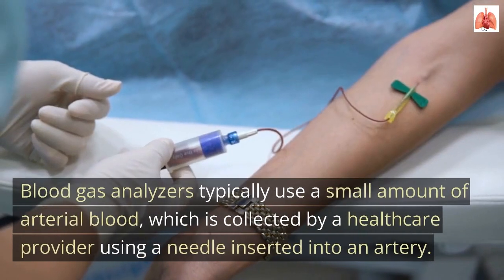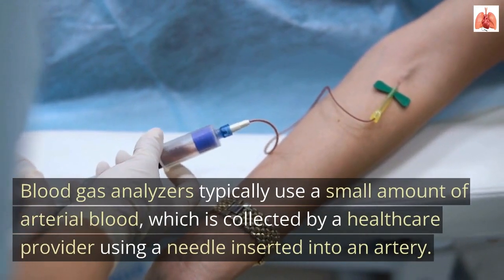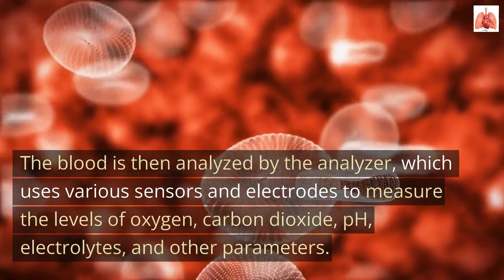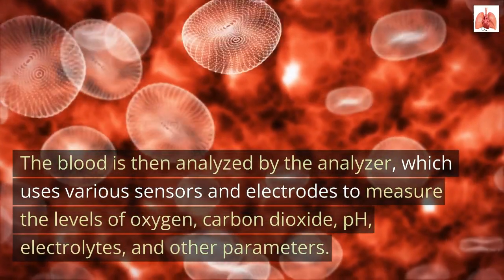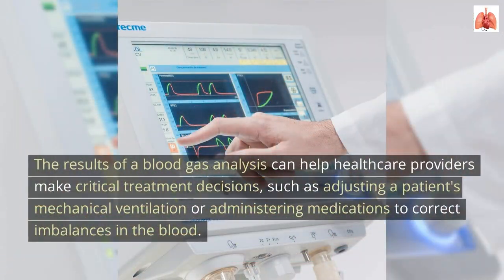Blood gas analyzers typically use a small amount of arterial blood, which is collected by a healthcare provider using a needle inserted into an artery. The blood is then analyzed by the analyzer, which uses various sensors and electrodes to measure the levels of oxygen, carbon dioxide, pH, electrolytes, and other parameters. The results of a blood gas analysis can help healthcare providers make critical treatment decisions, such as adjusting a patient's mechanical ventilation or administering medications to correct imbalances in the blood.